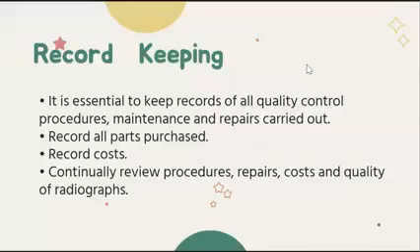You have to record all the parts purchased, no, record all the costs, and continually review the procedures, repair cost, and quality of the radiograph. So it is very much important that when you do something, you have to record it. No? When you have cleaned the processor, okay, I cleaned it at this specific time and this specific date. So that when something goes wrong, you can check the documentation to see where you went wrong, where you fell short.